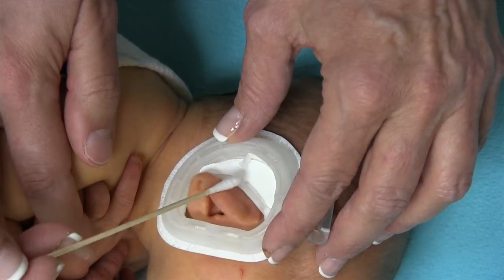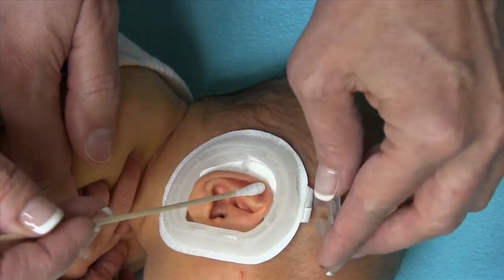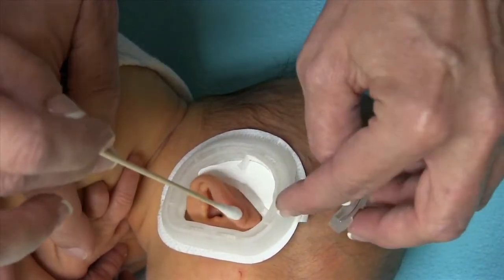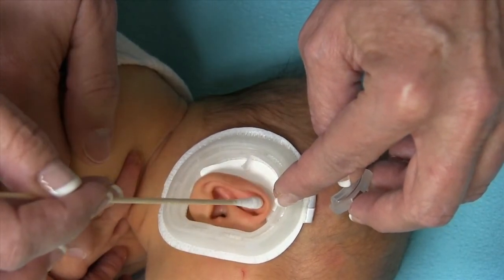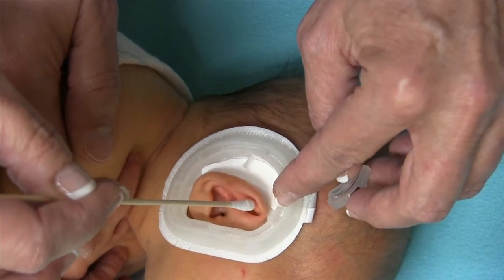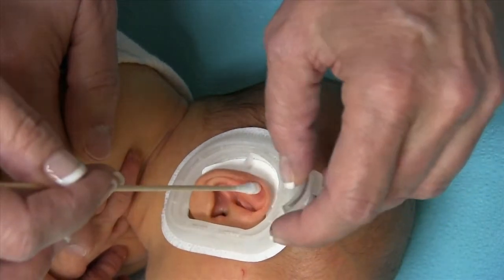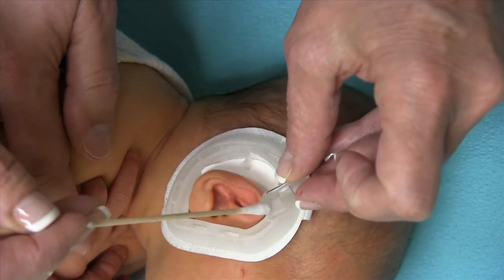Here's the posterior former, and you can see that if I put the retractor as high as I needed to on this, that's going to be sitting right on the edge of the posterior former right here. I need that retractor all the way up here, and if I do that, that's going to set me right on top of that.